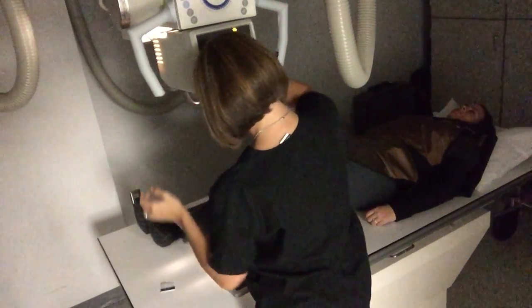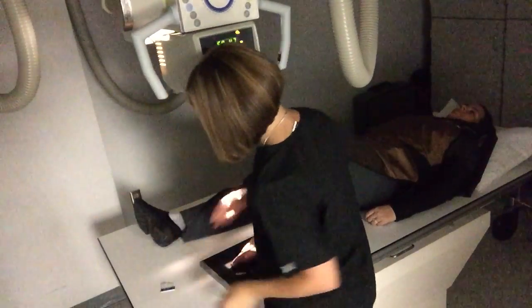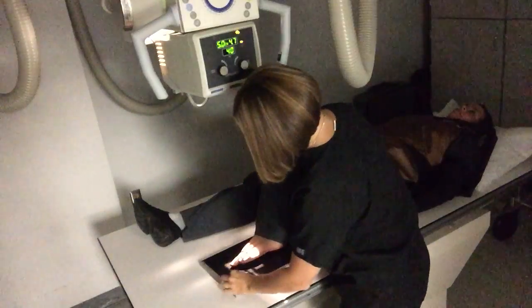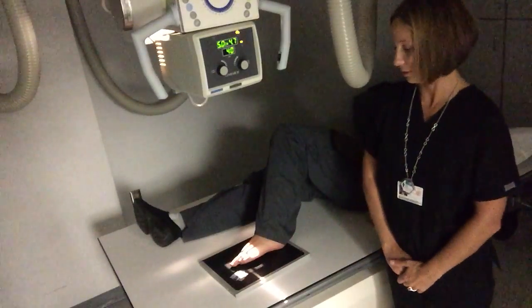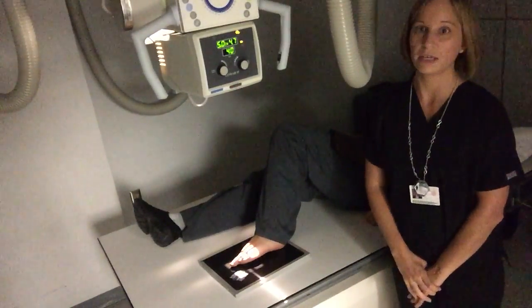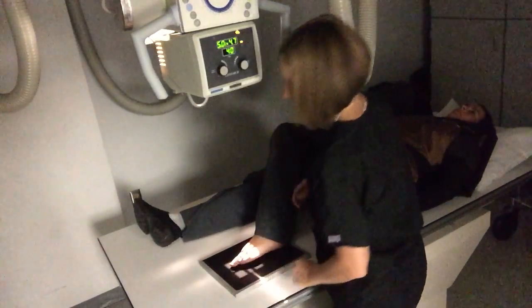Collimate as tight as you can to make sure that you get the toes and leave just enough room for your marker. This is the patient's left foot, so I am working with my left marker on the lateral side. This is also going to be at 63 kVp.